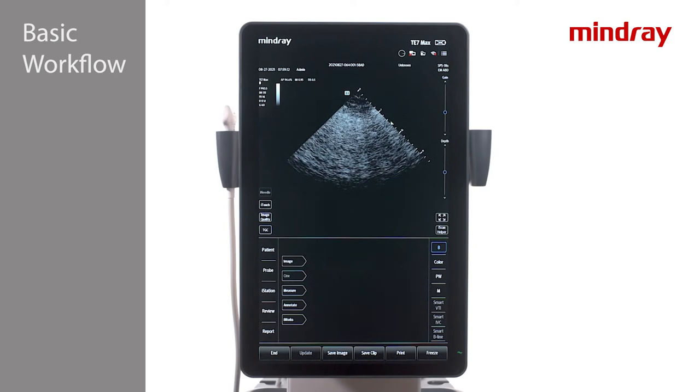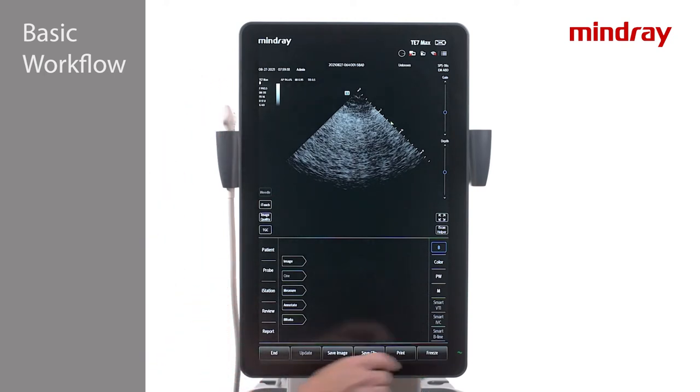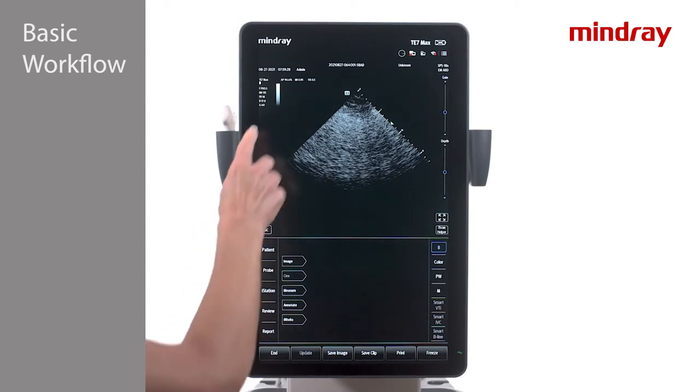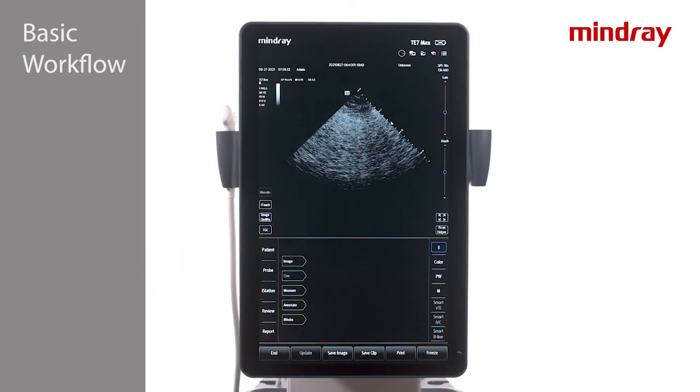The screen is divided into two basic sections. The top half is the imaging screen and the bottom half is the control panel. More detail will be given on the control panel items later in this series. The information banner along the top of the screen includes the transducer and imaging parameters, patient data, exam, and date and time.